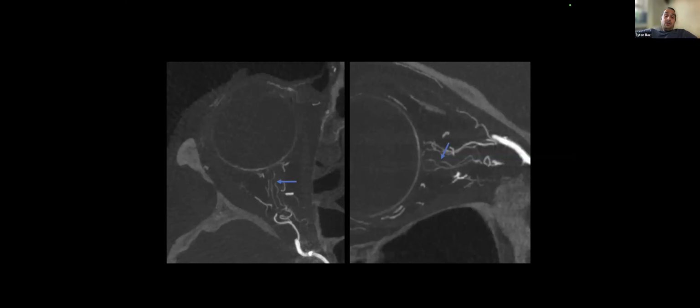Your question about contrast toxicity: I would argue that with a normal angiogram we inject much more contrast into the ophthalmic artery than the amount that I injected with a microcatheter here. Maybe the pressure is higher and can cause problems? I don't know. But in this particular case, or other cases in which we injected contrast in the ophthalmic artery directly, I do not recall a worsening or new problems just because of that.